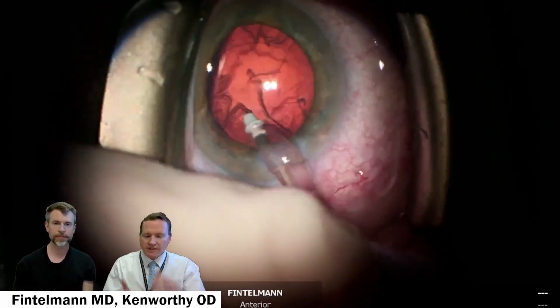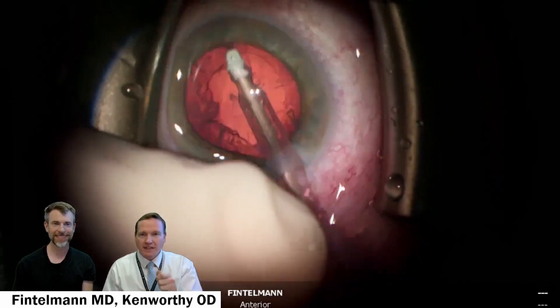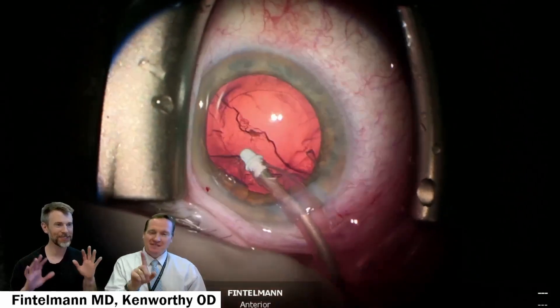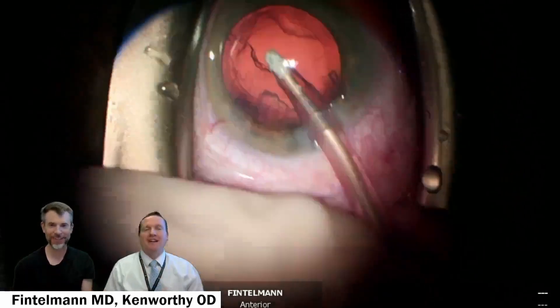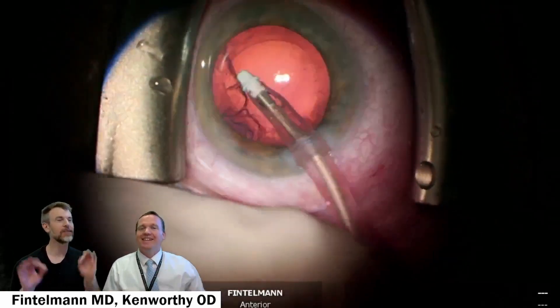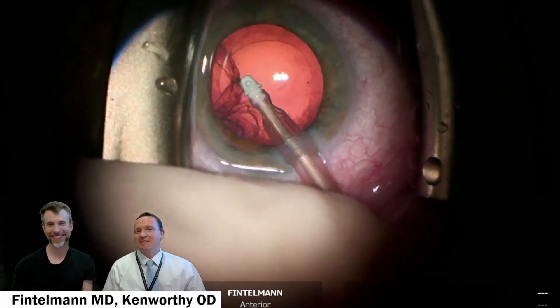I like the analogy used previously of a jackhammer for that phacoemulsification unit — just breaking it apart and pulling it through. Fine vibration might be a better term, otherwise people get concerned hearing 'jackhammer.' There's no jackhammer inside the eye. Let's stick with fine vibration.